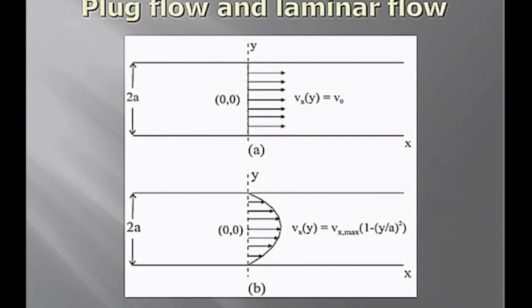So I'm going to show you just a little bit here about how we can measure flow in magnetic resonance imaging. Normally, if we're trying to teach something very simplistic about flow in a tube, we might assume we have plug flow. But in fact, we don't have plug flow. Through the vessels, if the vessels are straight enough for long enough, roughly 10 times the length of their diameter, then you'll develop parabolic flow, which means the flow is fastest down the middle and slowest at the edge where they have the greatest resistance.